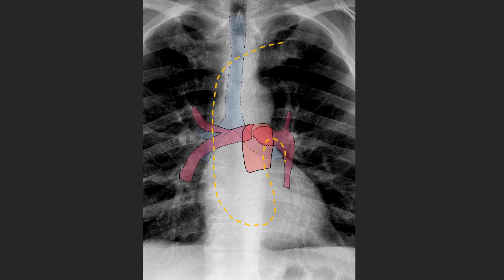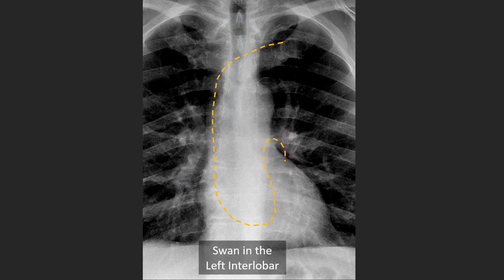Here's an example of a Swan-Ganz catheter within the left interlobar pulmonary artery. Notice how this catheter looks like it's looping on itself — this is not the case. It's just going up and over the left main stem airway and then down into the interlobar pulmonary artery. Again, we can see the left main stem airway in this area here.